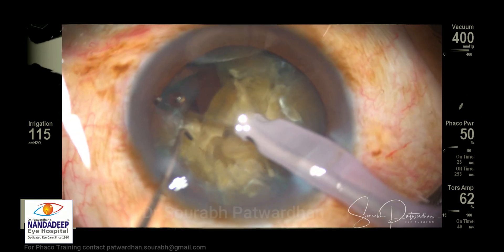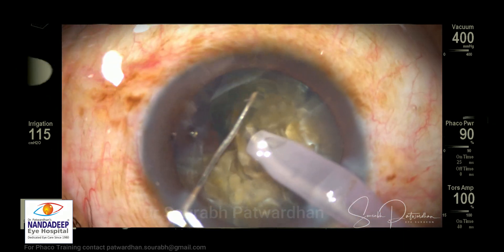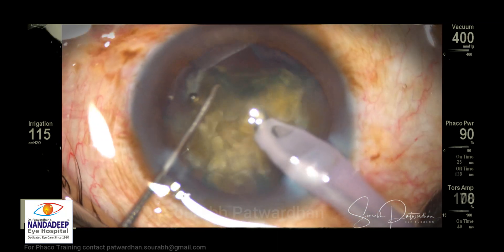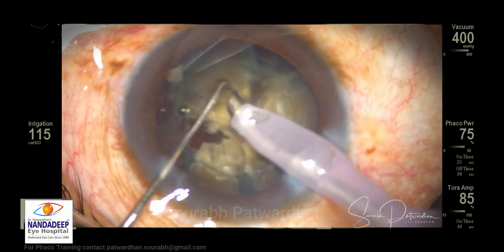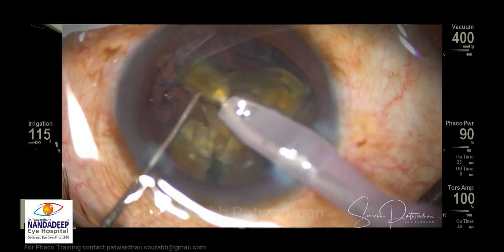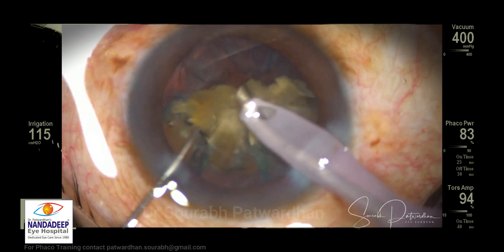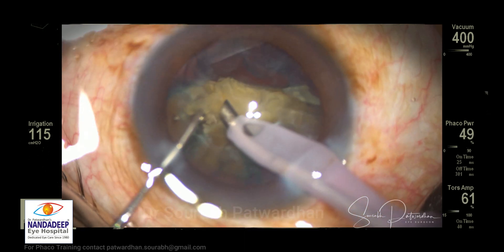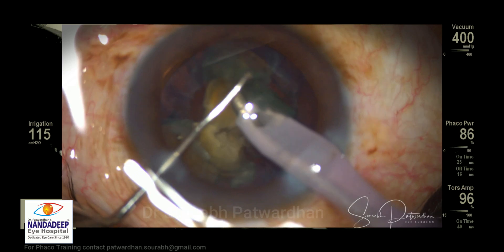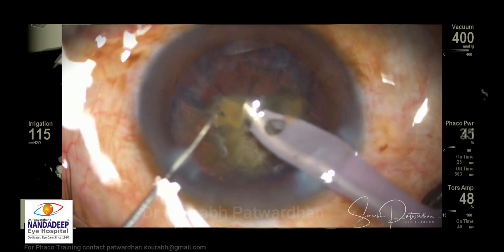There is no hurry, and now I am going to the quadrant removal mode. I am using the same parameters for the first part of the hemi nucleus — there is no need to change anything. The posterior capsule is well supported by the rest of the pieces, so I am not worried. The anterior chamber is very well maintained with no fluctuations. If there are fluctuations, you can see the pupil constricts after each piece when the occlusion breaks — that indicates surge, at which point you must reduce your vacuum. But here the anterior chamber is very well maintained with these parameters.